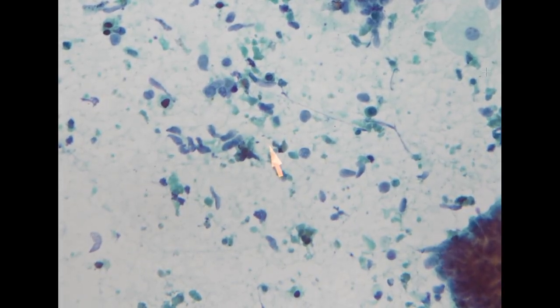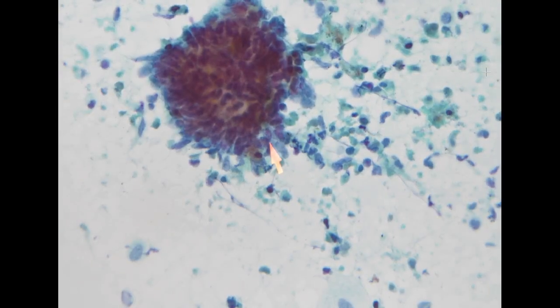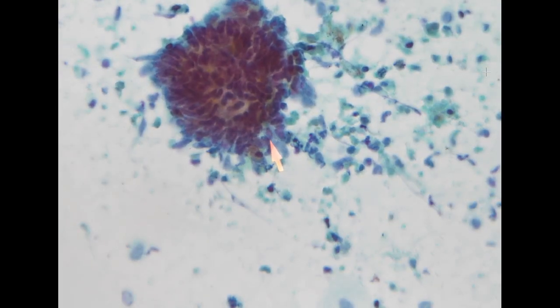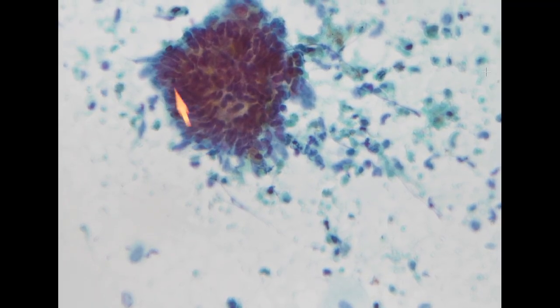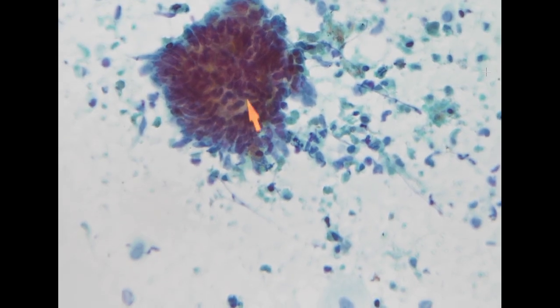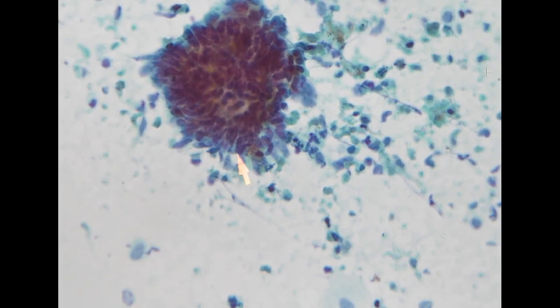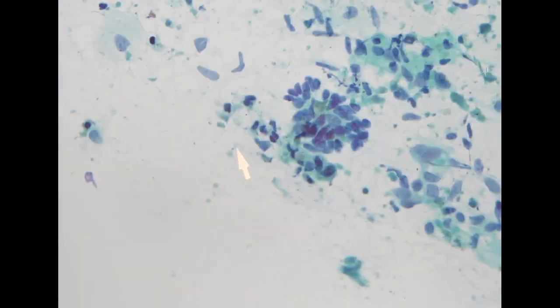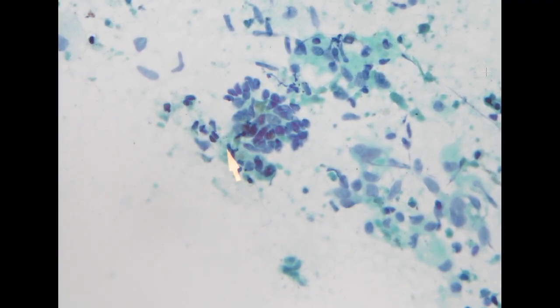It looks like a dirty necrosis pattern. So for these epithelial cells, you can see they are highly overlapping with very prominent stratification, almost looking like the feathering pattern that we see in endocervical adenocarcinoma in situ. So this is just based on the morphology.